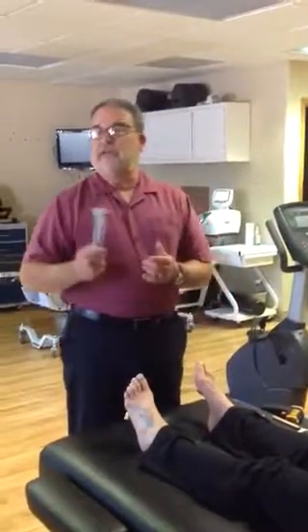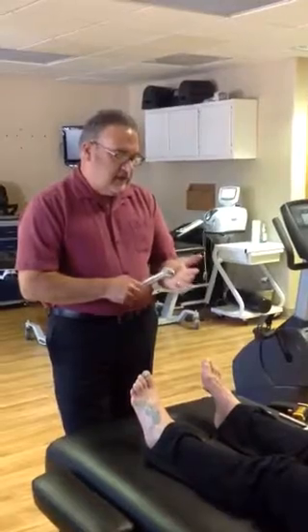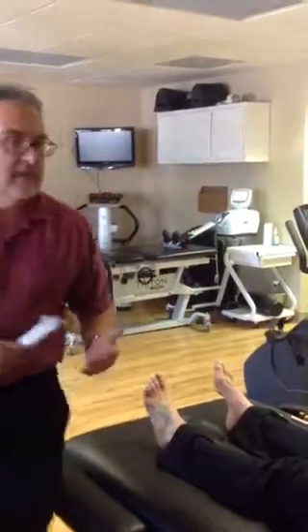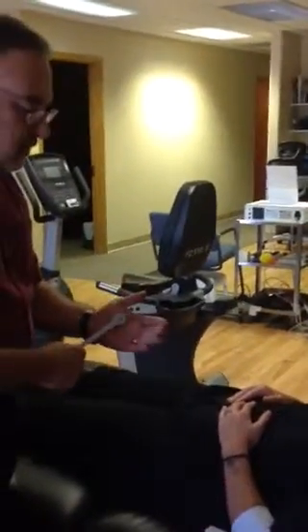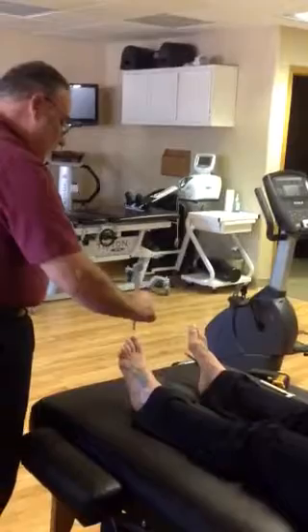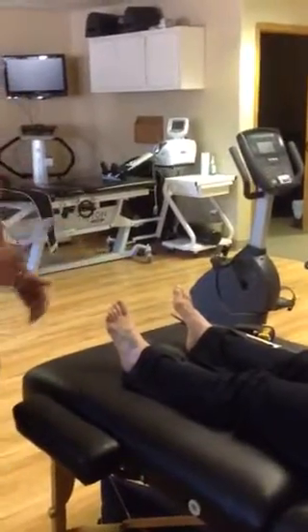The next thing I do is vibration. Vibration is a large nerve fiber test. I use this tuning fork and put it on the toe. I usually start at the clavicle and move down to the wrist, then the knee, just looking to see if they feel relatively the same, then go to the big toe. I get a little more specific and test the thumb, giving it a number 10 for vibration. Some people don't feel any vibration, meaning they've probably started to get large fiber damage or are fairly advanced. It's a subjective test but the patient gives me their number, so on a re-evaluation I can determine if things are coming back through different therapies.